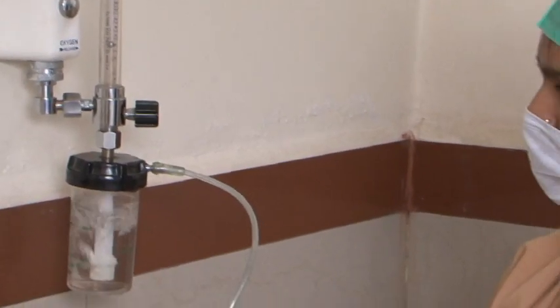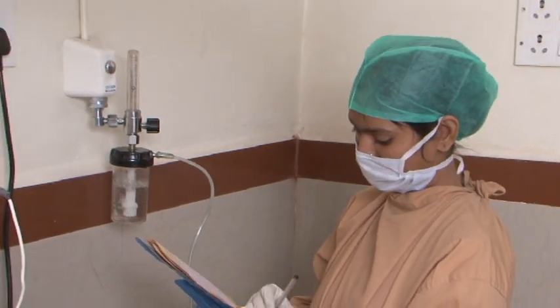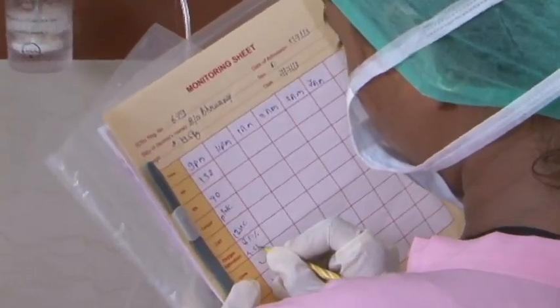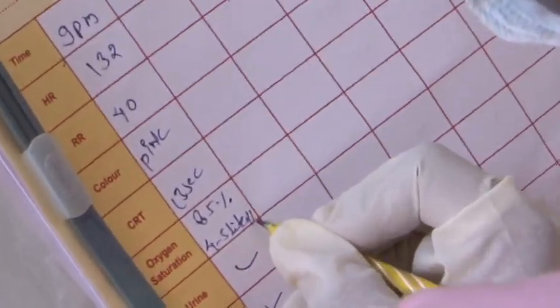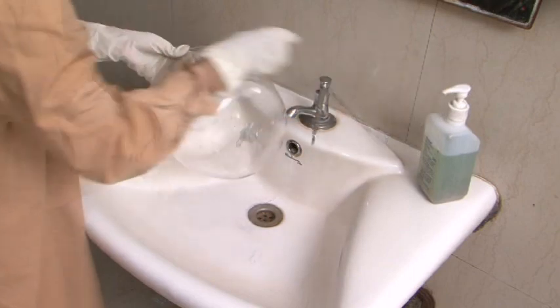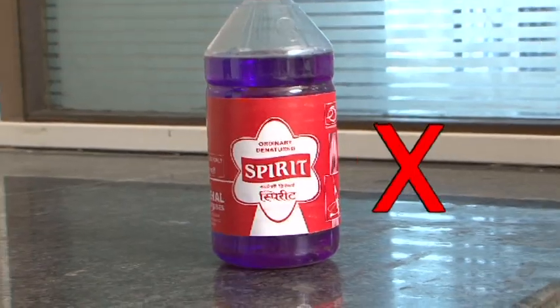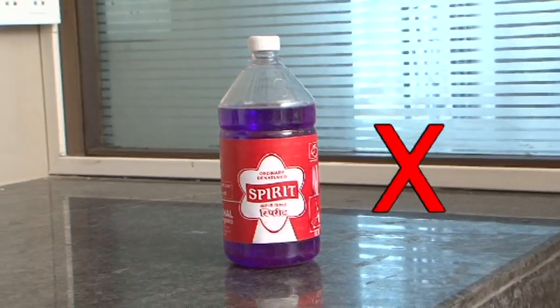Record time and rate of oxygen administration. The oxygen hood should be cleaned using soap and water. Never use spirit for cleaning.